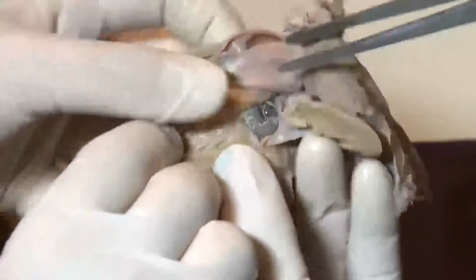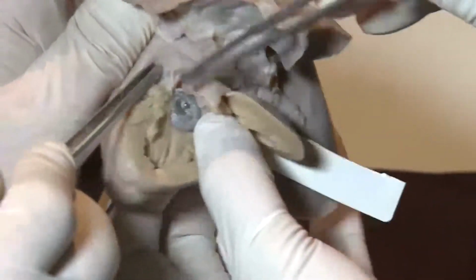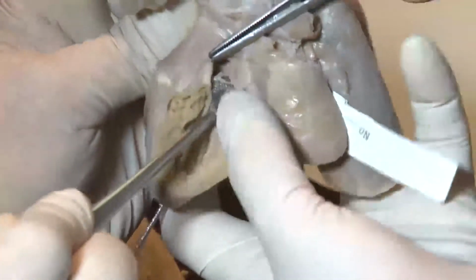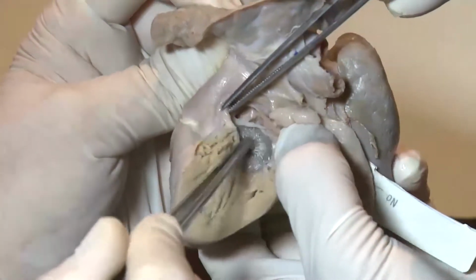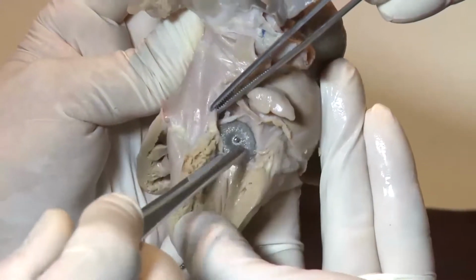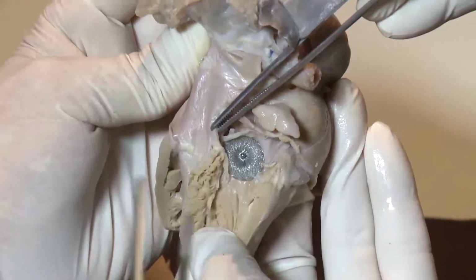So when you see the LV side, I would like to show you the aortic valve leaflet. Can you see? It's a little bit big device, but it's under the aortic valve leaflet, even though it's big. But the problem is there is a left bundle branch, and so the device touched the left bundle branch. So as time passed, there may be a fibrotic change, so bundle branch block may occur.